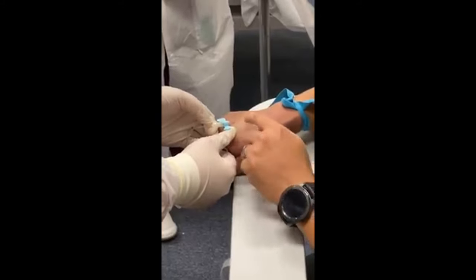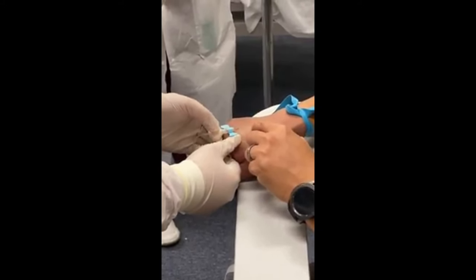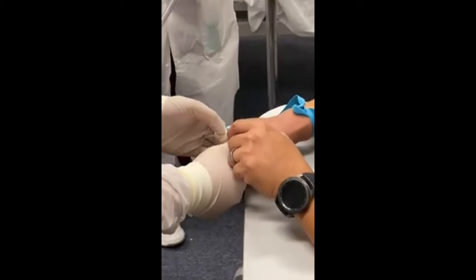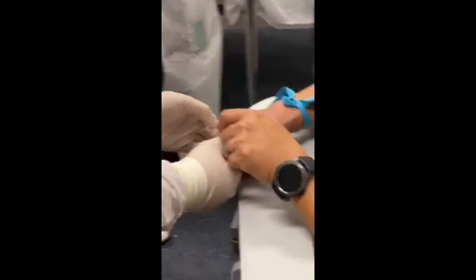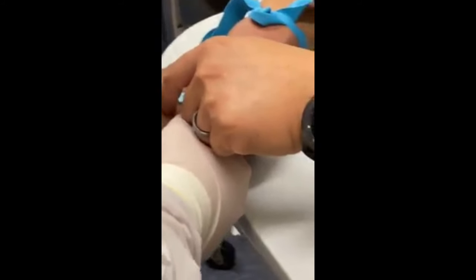Okay, so for this one, you could just try to pull back out a bit. Okay, and then go. Or pull back some more. Okay, and then just turn it this way. And then go.